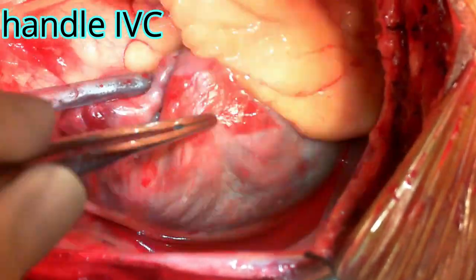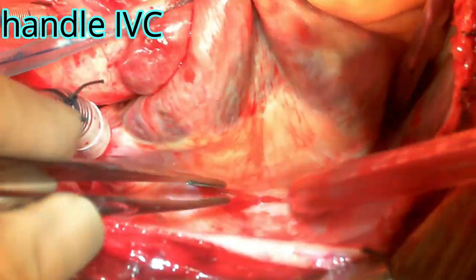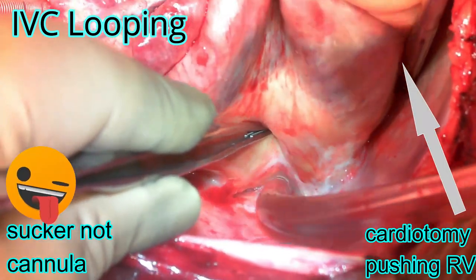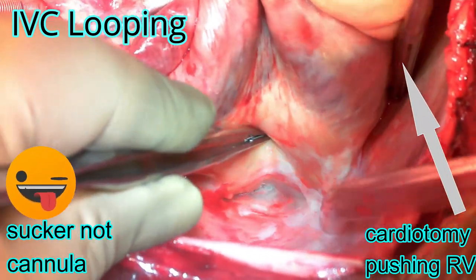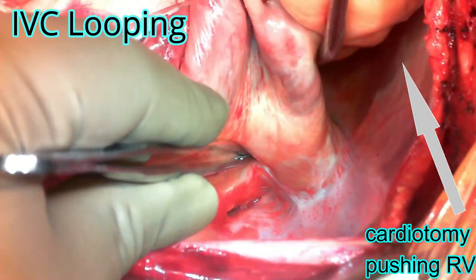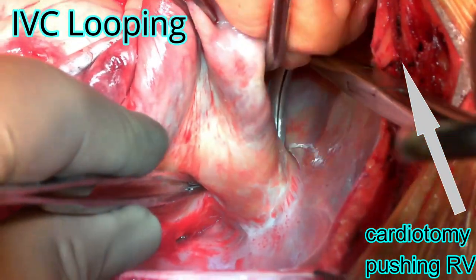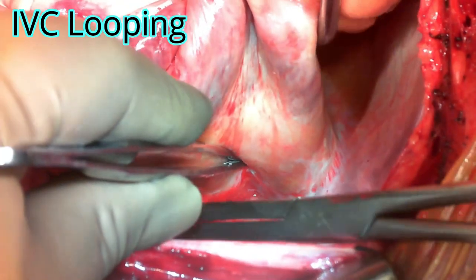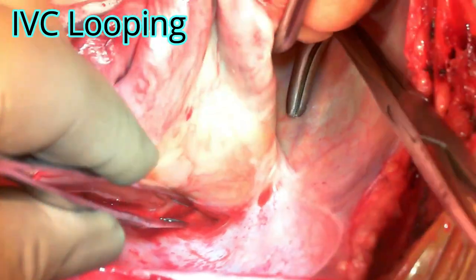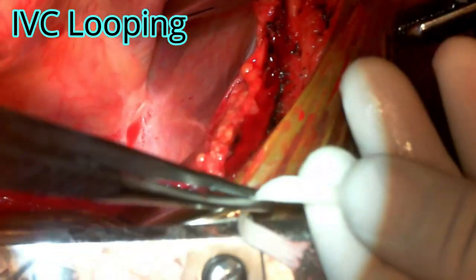Now attention turns to looping the IVC. You can do some blunt dissection as seen here, and then loop the IVC. The cardiac sucker placed in the oblique sinus is pushing the right ventricle away — this is a very important and excellent maneuver both for cannulating the IVC and for going around it. As you can see, the whole IVC is very well exposed, and you can easily pass a caval tape around it so that at a later stage you can snare the IVC to establish total cardiopulmonary bypass.